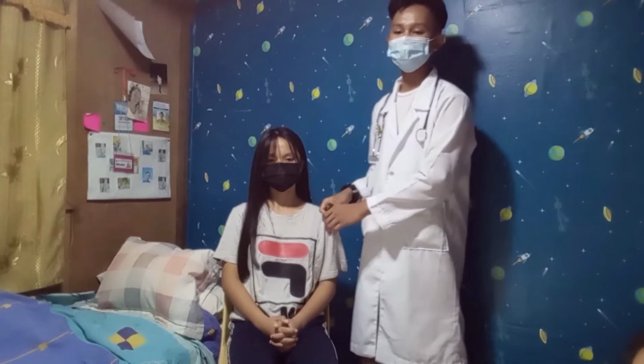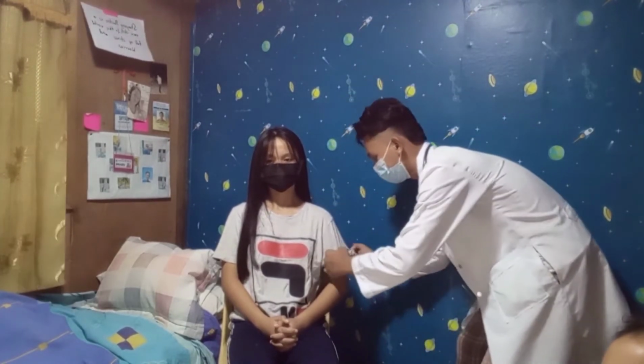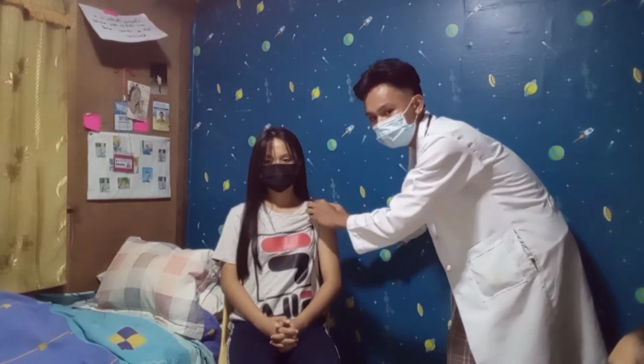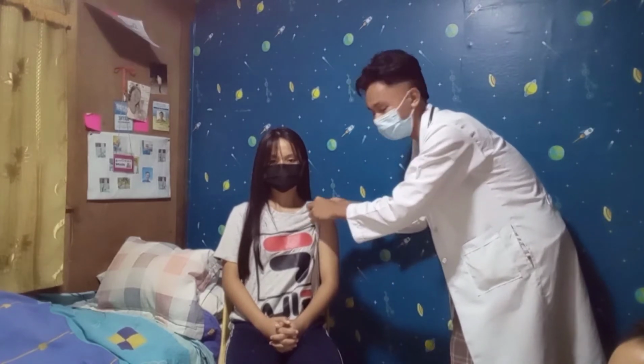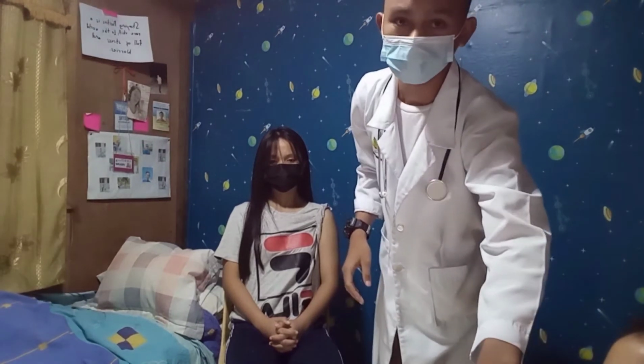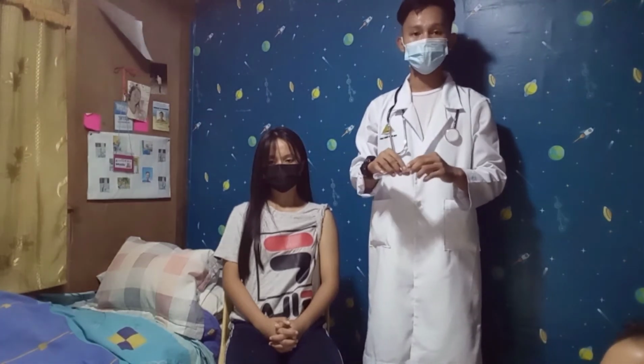Expose the patient's axilla by securely folding the client's shirt, sleeve, or gown up to the deltoid region. If the axilla is moist, dry with the patient's towel using a patting motion. Remove the thermometer from the container. Cleansing from an area where there are few organisms minimizes the spread of organisms to a cleaner area. Friction helps to loosen matter from the surface.